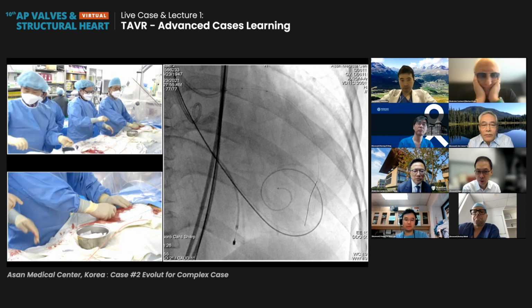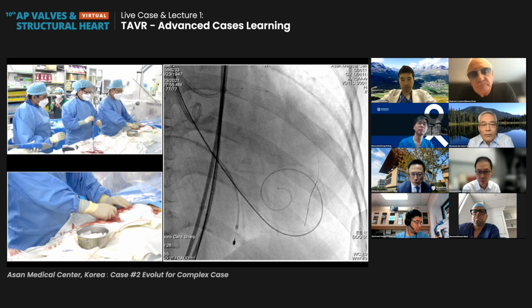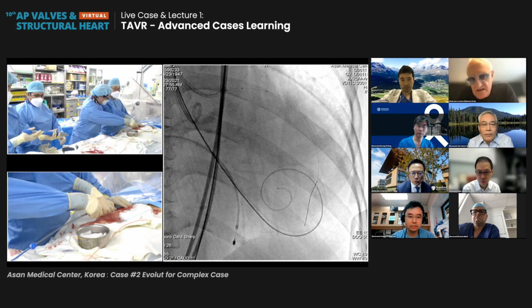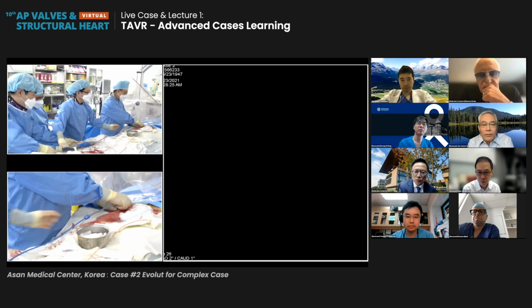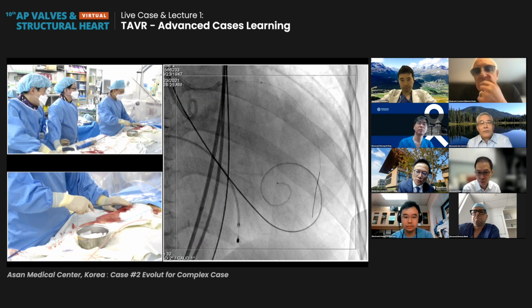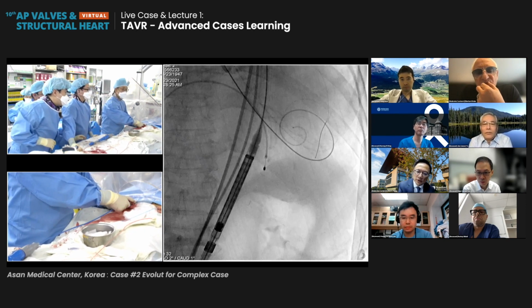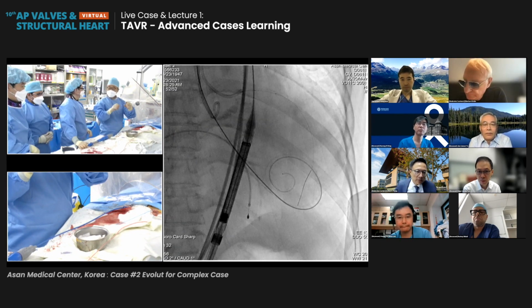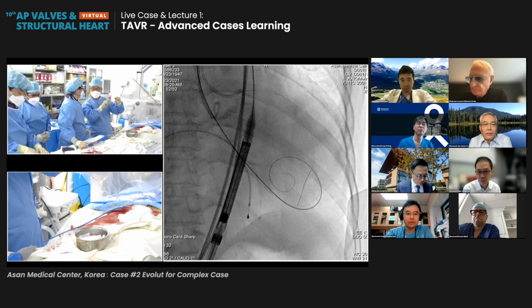So, Evolut R system, the height of the inner skirt at the suture line is 14. And the coronary height in this patient is 10. So if you consider the height and node 0 and node 1, that is 6 millimeter. So if you're going to insert over here, if you want to put at least more than node 1, yes, we make sure the inner skirt is 14. If you're going to put node 1, there is 6 millimeter. Yes, we have the 8 millimeter height from annulus to coronary height.